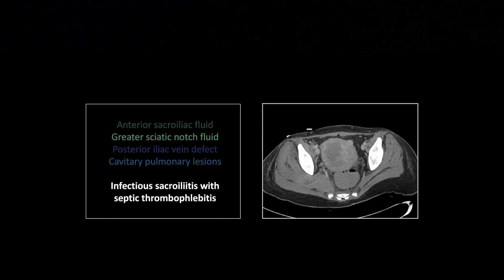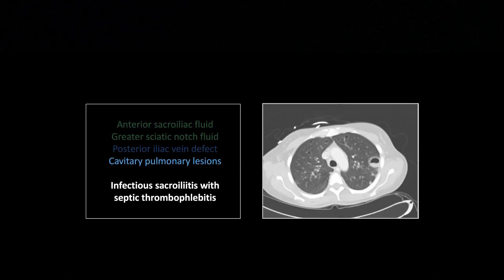So what you have is infectious sacroiliitis with septic thrombophlebitis of the posterior iliac vein. This also extends out the inferior and posterior aspect of the sacroiliac joint into the greater sciatic notch — a fluid collection extending into the external rotators, representing another decompression of the septic sacroiliac joint. And because we have septic thrombophlebitis, we're back to the pulmonary theme.